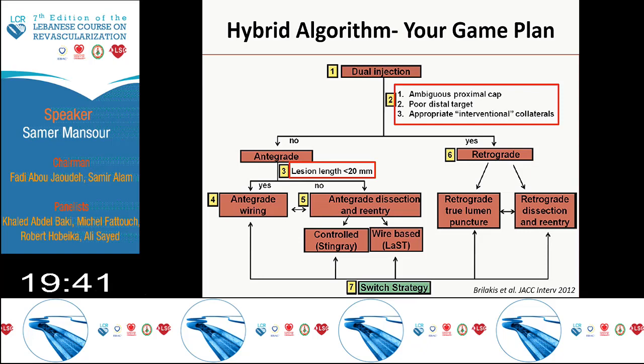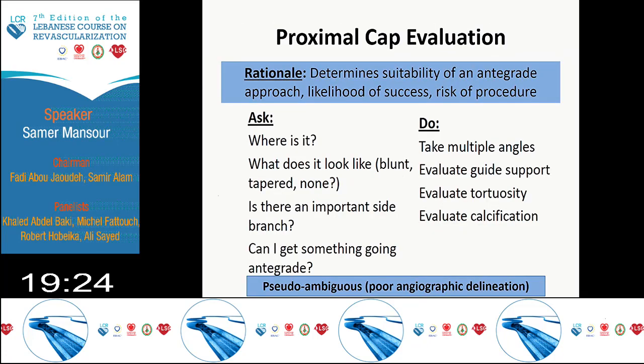This is a movable target. You are not stuck in a tunnel where you need to continue in the same way. If it's not working with this approach, move to another approach. Don't spend a lot of time giving radiation, giving contrast, and getting tired by two hours of working just hitting one approach. Move from one approach to the other one.